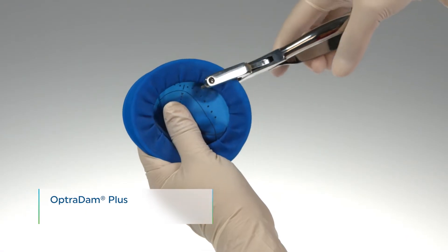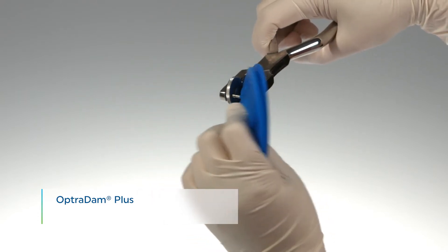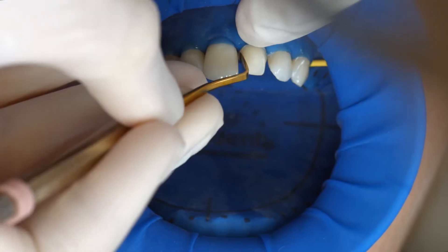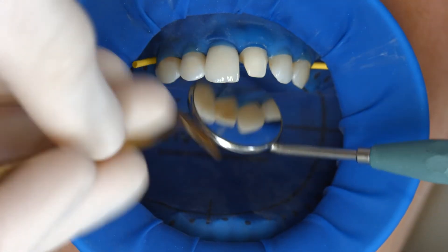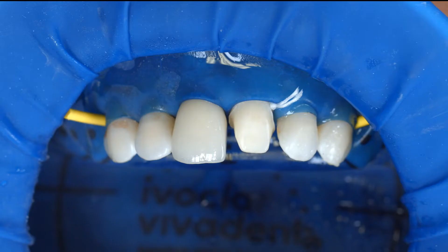When an adhesive luting protocol with composites is used, reliable isolation of the operating field is indispensable. Preferably, place an anatomically shaped rubber dam such as the Optro-Dam, or alternatively use cotton rolls and a saliva ejector.